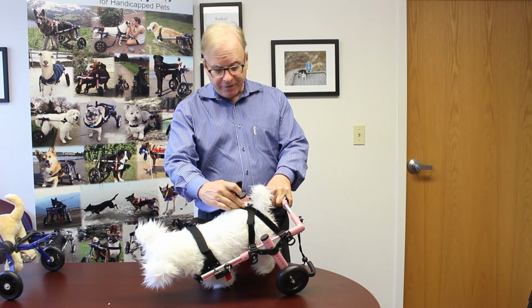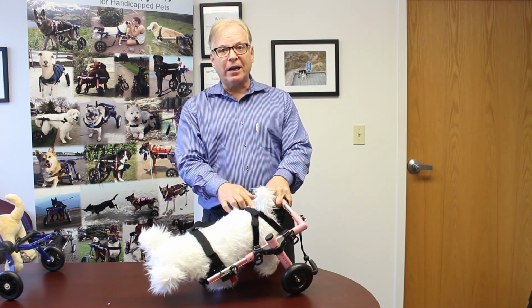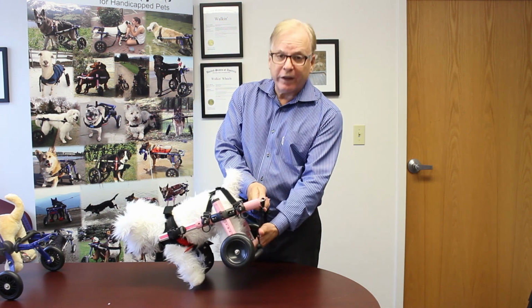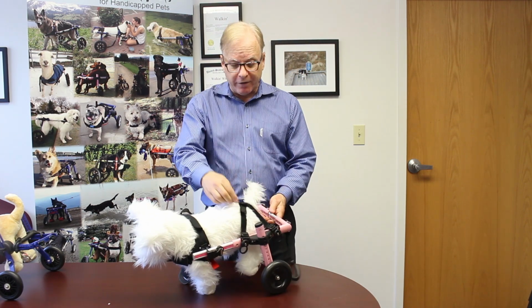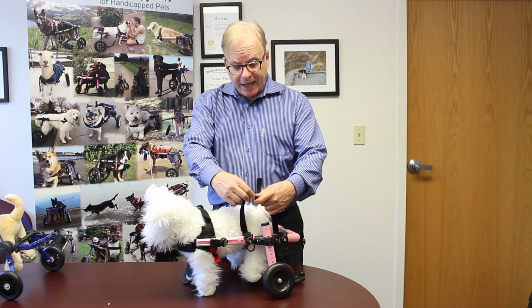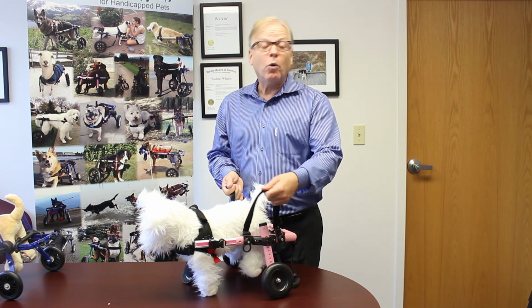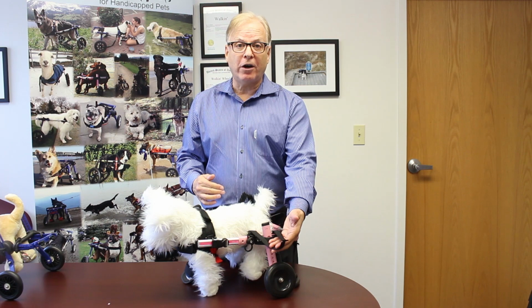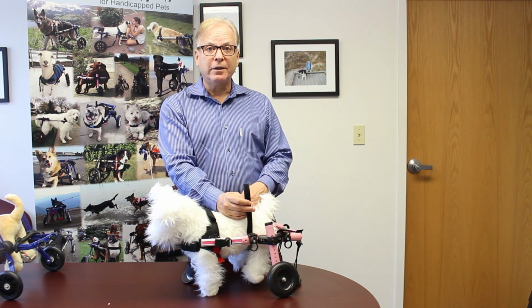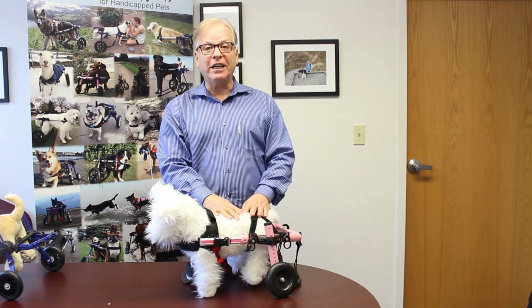In addition, these straps, if they're not used to make the leg rings longer, can cross across the back like this to hold the dog into the rear harness. Sometimes very active dogs with some strength in their rear legs will push themselves out of the harness. These straps can stop that. If the straps aren't needed for that, they can be used as a lifting harness to help lift the dog in and out of the chair. Or, if the dog doesn't need them at all, they're easy to cut off. So the reason for the excess straps is to make the wheelchair versatile, to accommodate dogs with extra strength in their back legs, or just to use as convenient lifting handles.